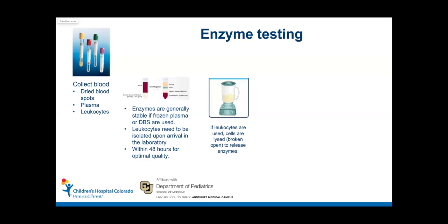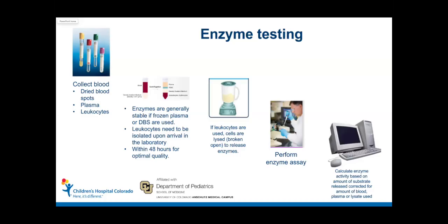So once we get the leukocytes, we grind them up a little bit. It's not really a blender, but it's a good example of what happens. We release those enzymes into a test tube. You have a very competent technologist who performs the enzyme assay, trying to read the fluorescence using the slide I told you before. And then we have to do some calculations, and that's the last thing that I want to talk a little about, because we're expressing this enzyme activity as the amount of substrate that's released for the amount of blood, plasma, or lysate that we use. And so what can impact this calculation? And that's a little bit about what I want to tell you.